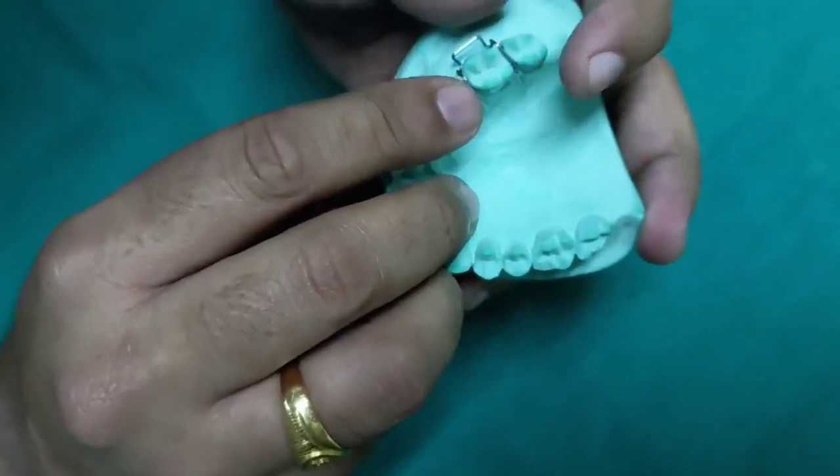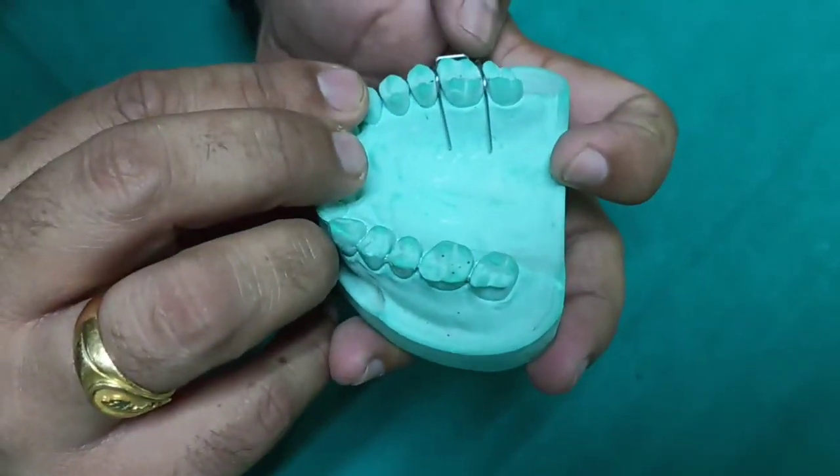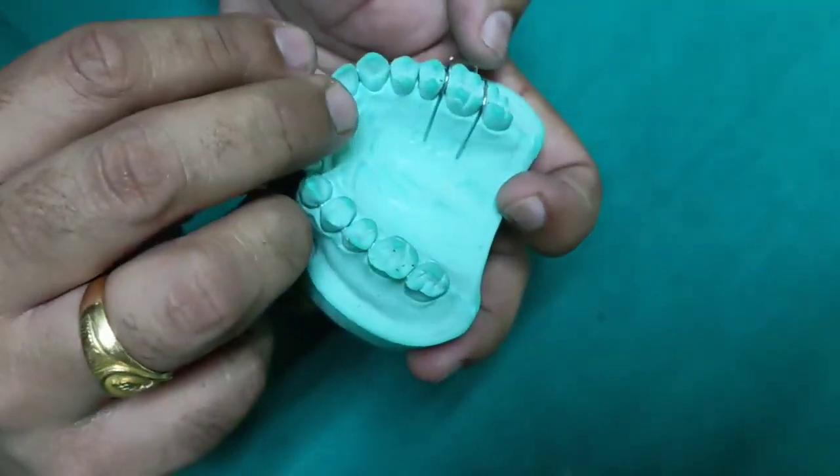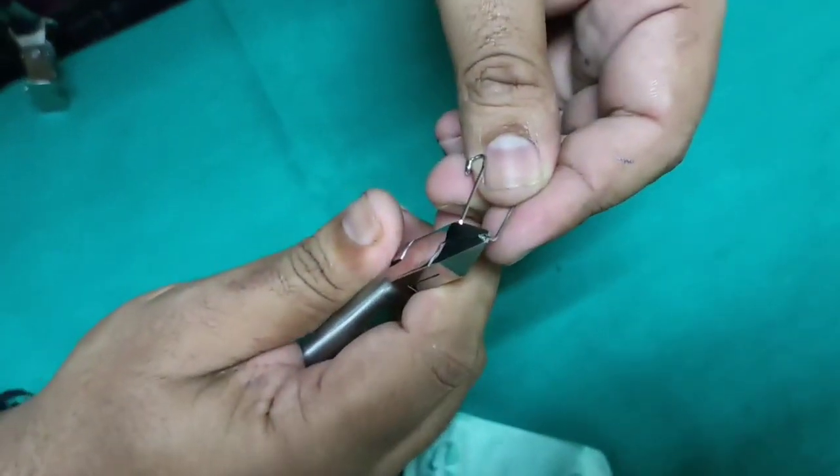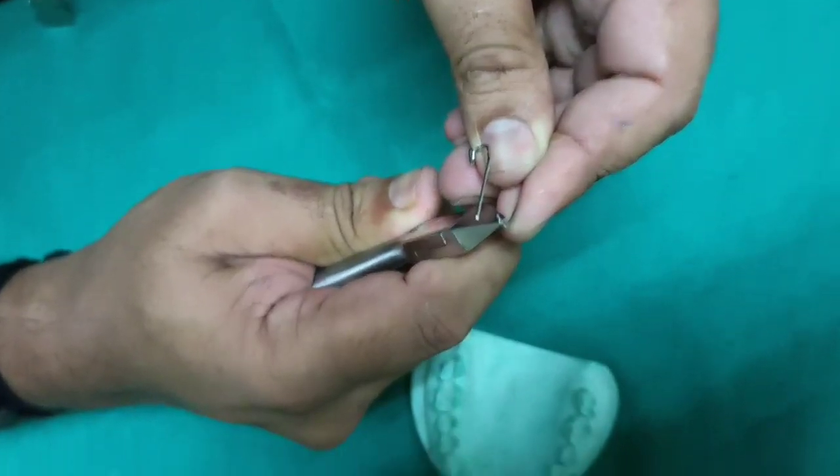The checkpoints for a good Adams clasp are: the bridge should be straight and have a clearance from the teeth and gums. The arrowheads should be parallel. The tag should fit closely across the contact point.